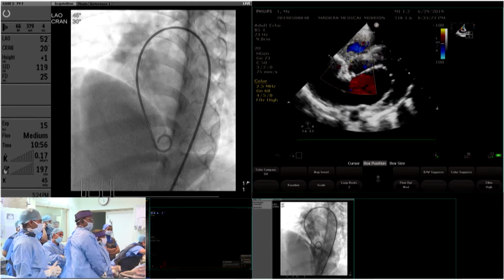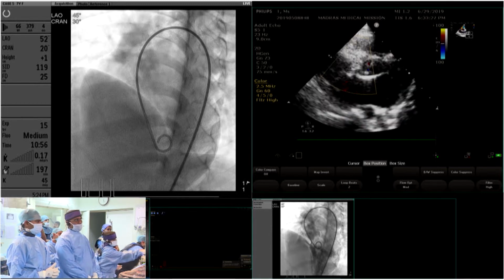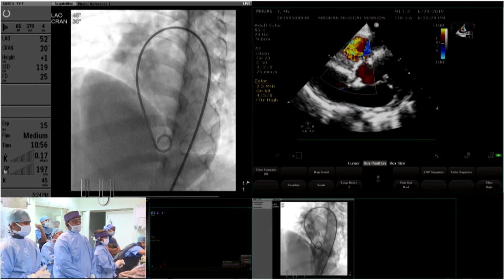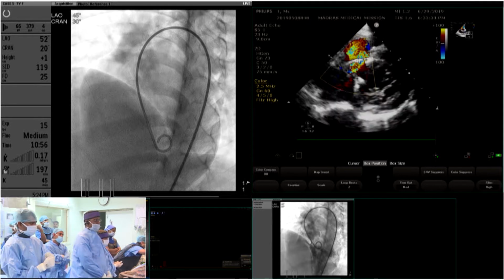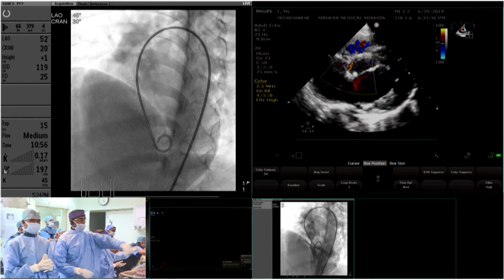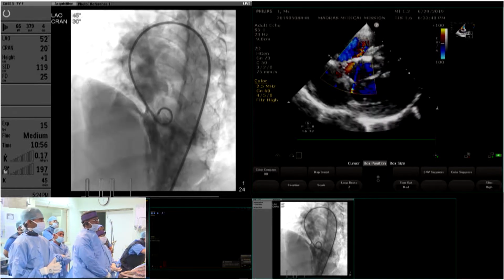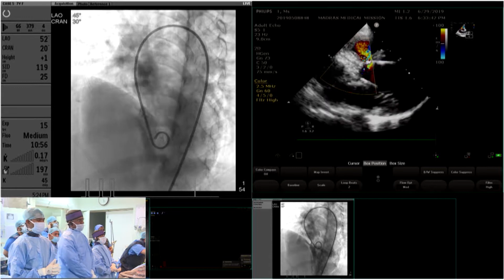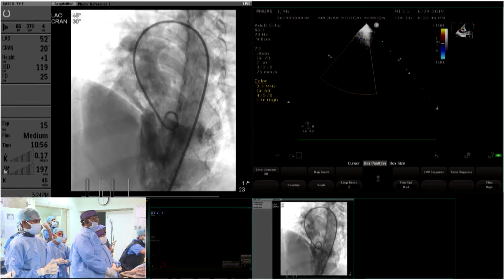Show the perimembranous VSD. Sweep down. Jesse, what else do we need from information? You're going to show us a left ventriculogram, I assume. Yeah, so left ventriculogram we are going to show now. Show the angiogram. So this is the left ventriculogram. Freeze the frame. Yeah. Okay.